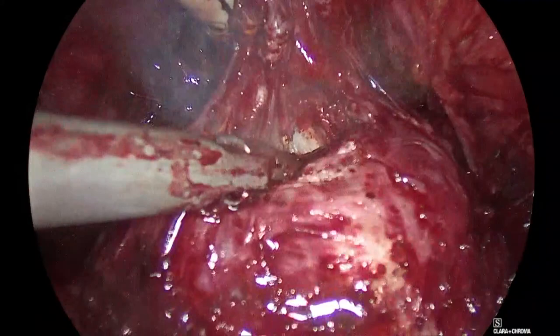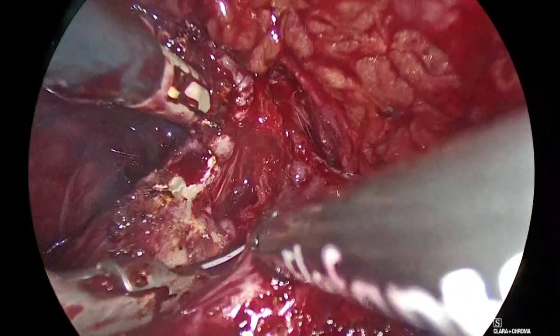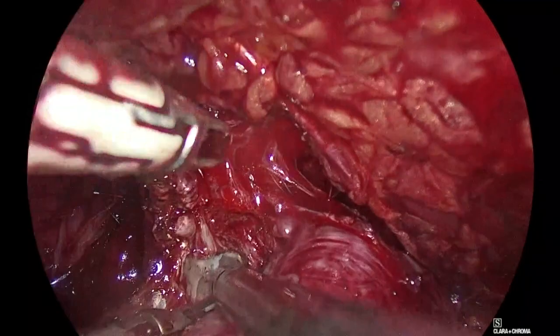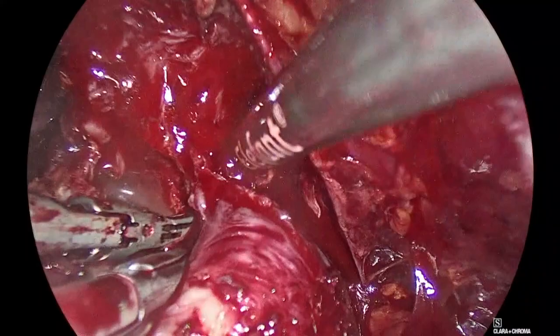Do not aspirate continuously, Panagiotis. Prostate apex there, in. Sorry, Alan. Go. You're dissecting your urethra well into the prostatic apex, aren't you? Yes. Good. Show me. Show me. Badeli, you're rotated. Aspirate inside. Inside. Good, good.